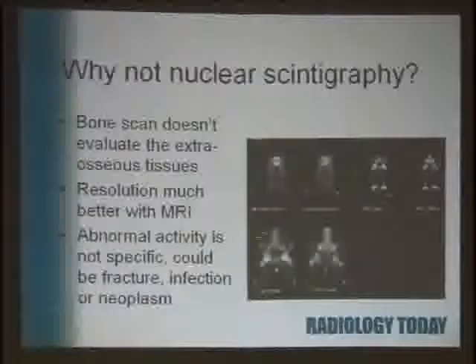So that means you're picking an area, and you're trying to assess abnormality in soft tissue versus bone in that area. So if you're doing a 3-phase, you would have to pick one area. You can't get the whole body. You can always get the whole body on delayeds.